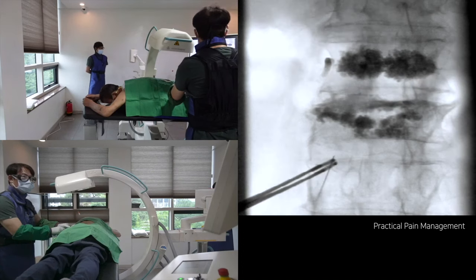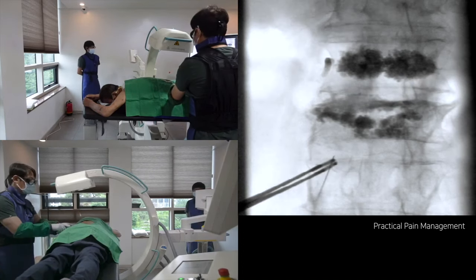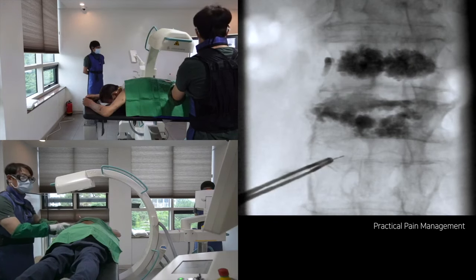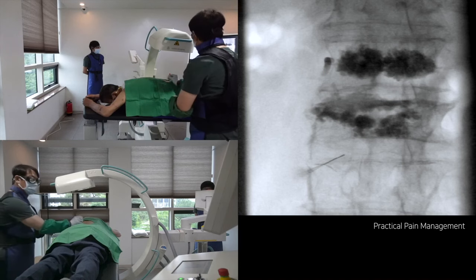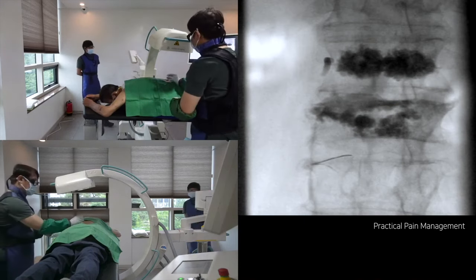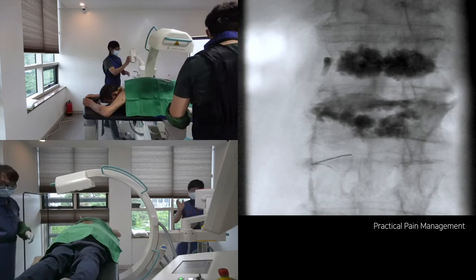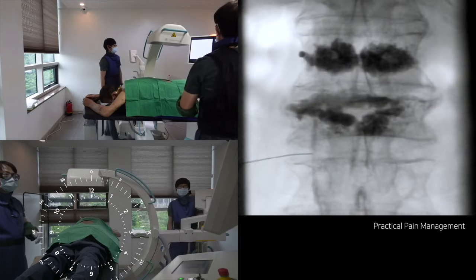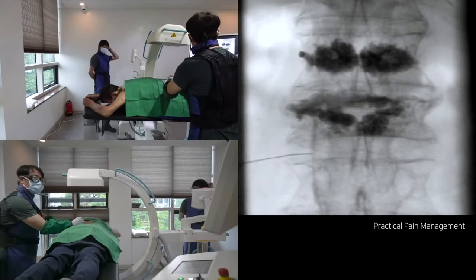As we watch the C-arm image, it is difficult to observe the transverse process and lateral aspect of the lamina. Go to the central region of the foramina and move the needle cautiously while monitoring the patient's response and sensing your tactile feeling. Let the C-arm go neutral and interpret the needle tip against the lateral aspect of the lamina.